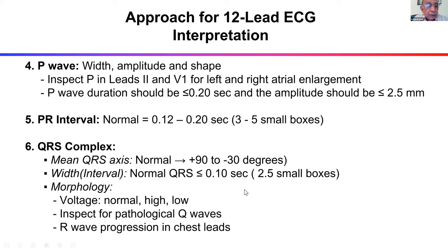Here we usually measure the QRS axis, the electrical activity, and we have to define the morphology. Because this particular deflection of the ECG represents ventricular depolarization, where most of the mass of the heart actually contributes to the formation of the QRS complex. So most of the derangements in different disease conditions, starting from ischemic heart disease, hypertrophy, electrolyte disturbances, and ionic changes, are reflected in the QRS complex. So this is really complex. The name is complex, and possibly the assessment is also complex.